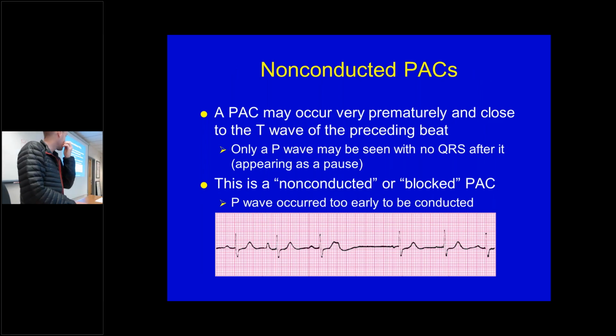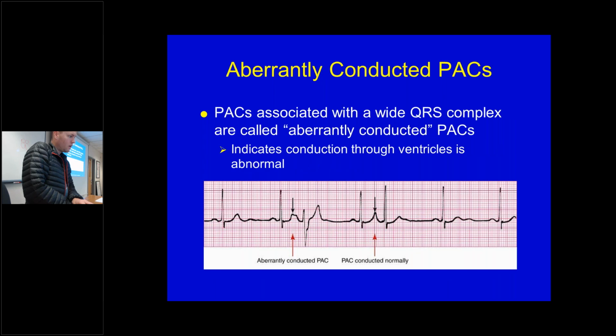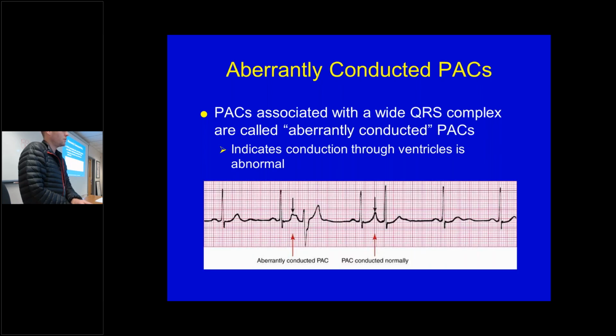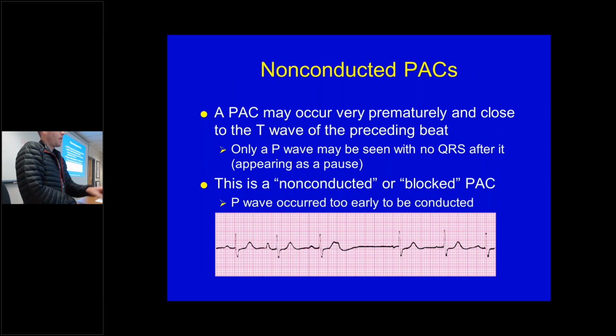So this is what you guys were already identifying, is that PAC can occur close to or with the T wave. So let's see if we can. So in this one, the PAC happened during that T wave, and it could have been just a millisecond late enough that it still gives a QRS, right? And this one, the morphology of those two T and P waves look fairly similar, Dr. Ray, but you had a PAC that was blocked. We don't see your mouse when you're moving, so if you can just show us on the board.